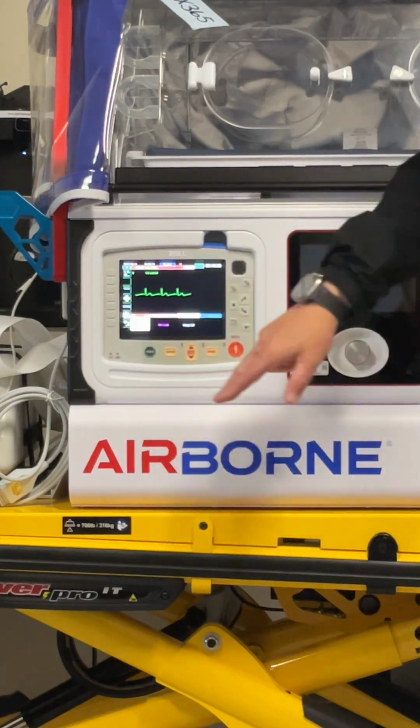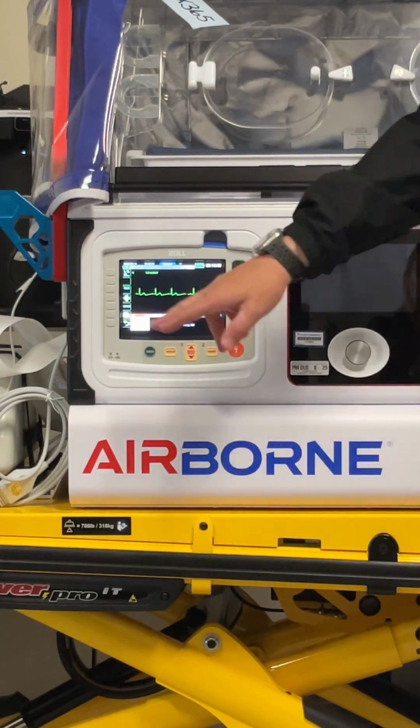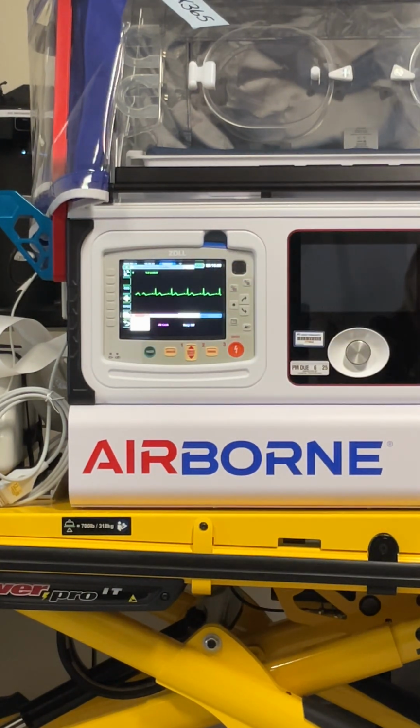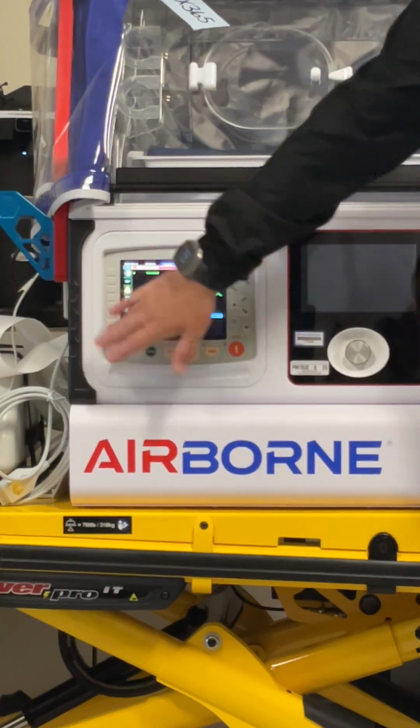Any questions on code markers? Okay. We're going to skip sync because we'll do that one later. Roll of paper, we talked about that one. It just starts and stops your paper, it doesn't print anything. Use the boomerang arrow or the more back key.